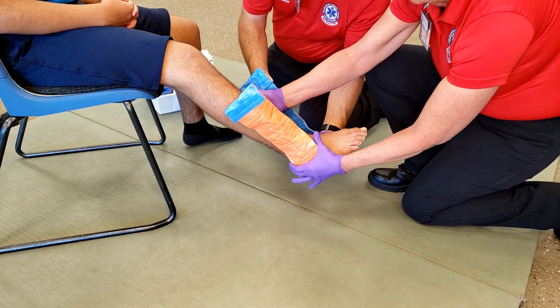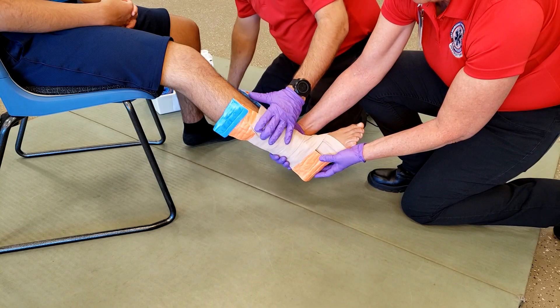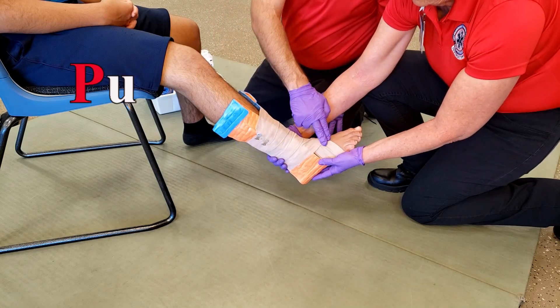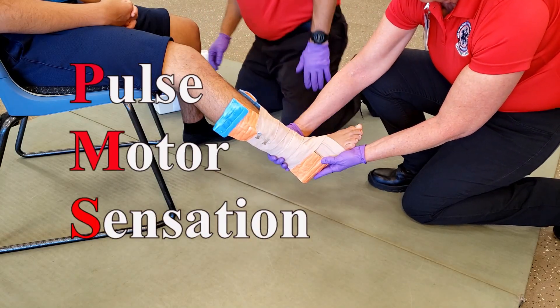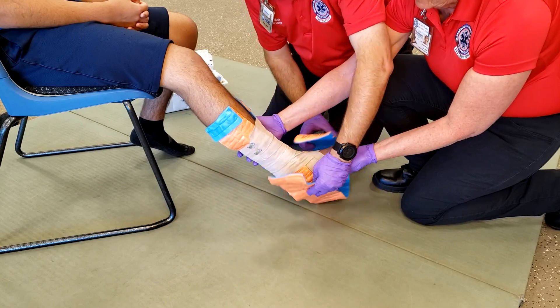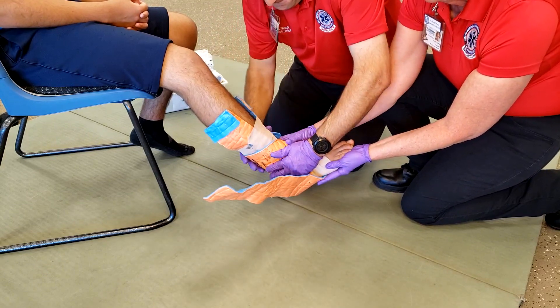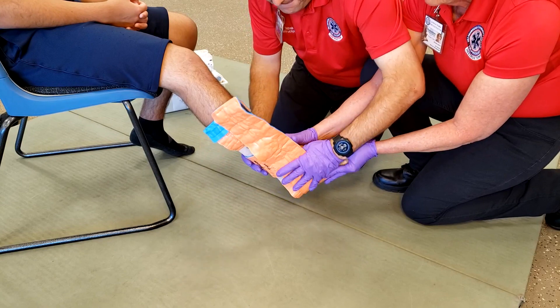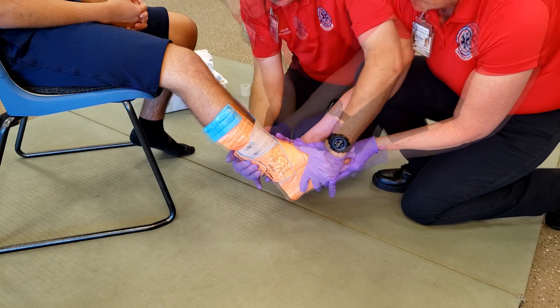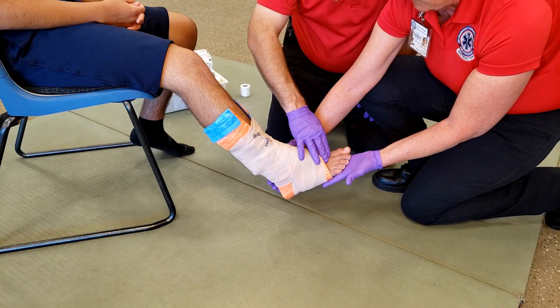Once finished measuring the device, place it against the injured side as your partner continues to hold manual stabilization. Secure the SAM splint starting from the distal side to the proximal side, then check for pulse, motor, and sensation once again. You may use a second SAM splint for more support, wrapping it in a figure-eight method beginning from the bottom part of the foot. Secure the second SAM splint as well, and once again check for pulse, motor, and sensation.